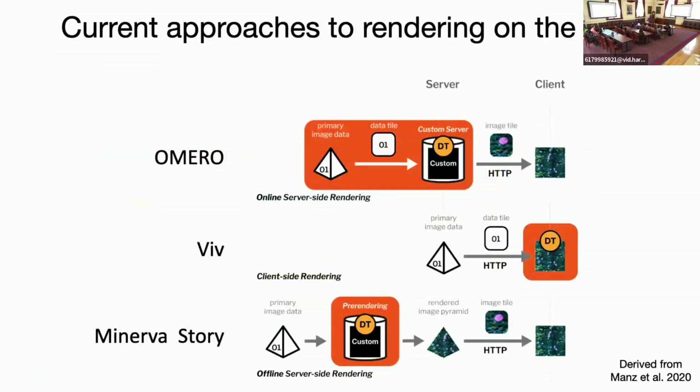There's a few different approaches to solving this on the web. One of them is the OMERO approach. OMERO is an open source microscopy image management tool. It solves the problem by pushing all the complexity into a server process. Somebody's got to maintain that server, care and feeding, updates, and all that, computing power. But then all the rendering happens in the server, and then it just ships a compressed JPEG to your browser, and that's that.